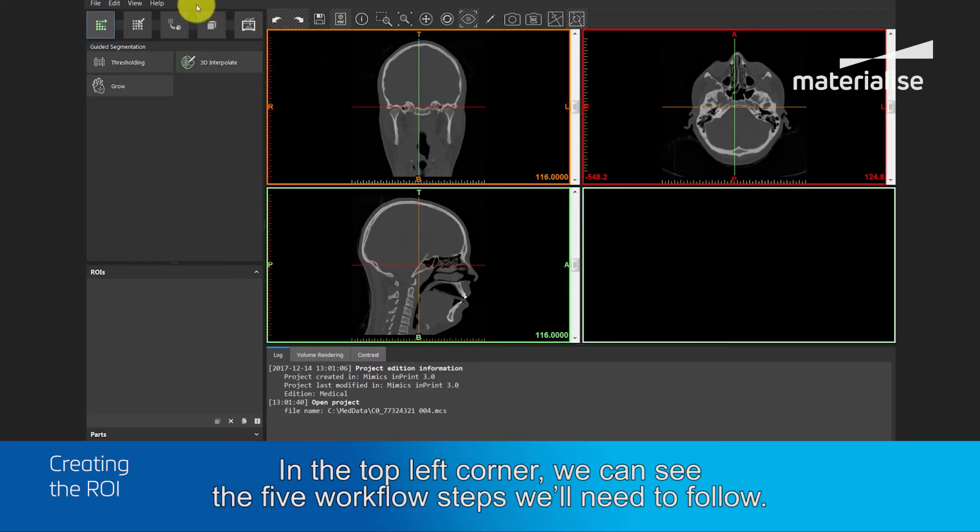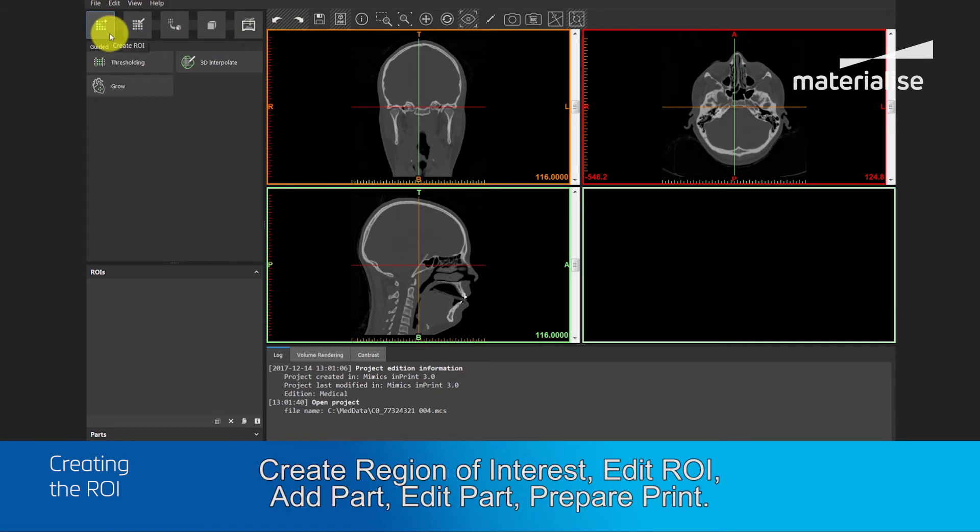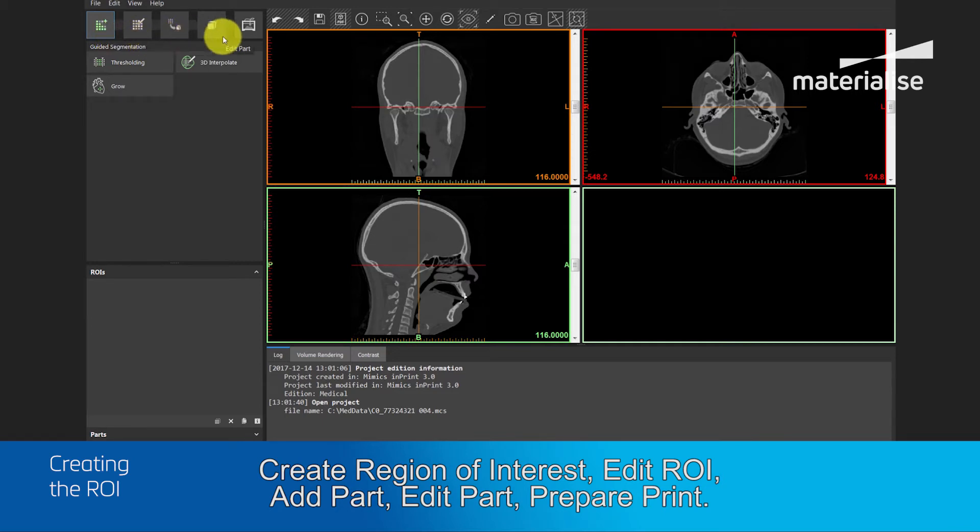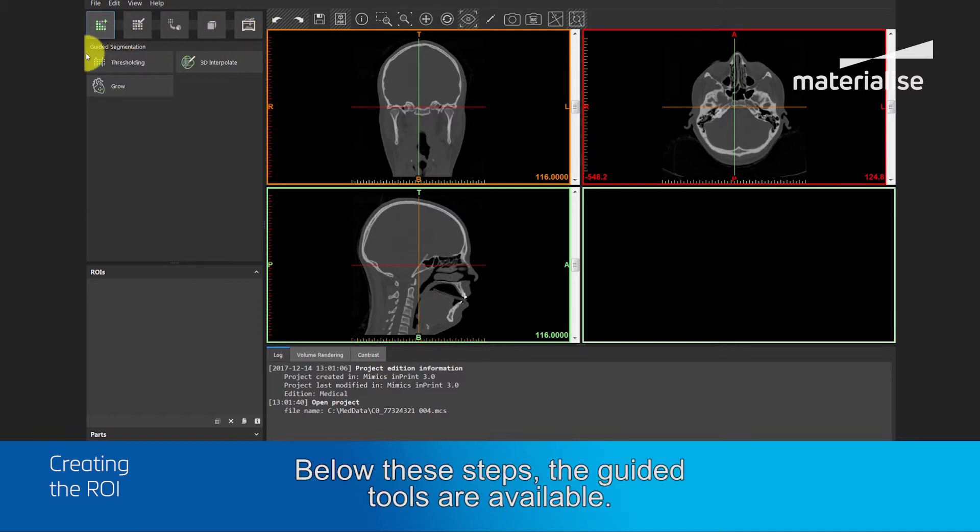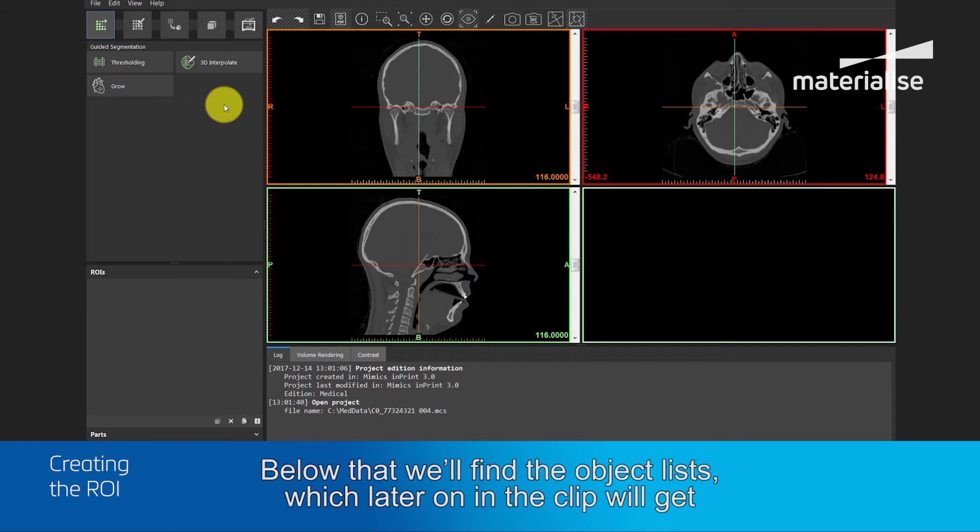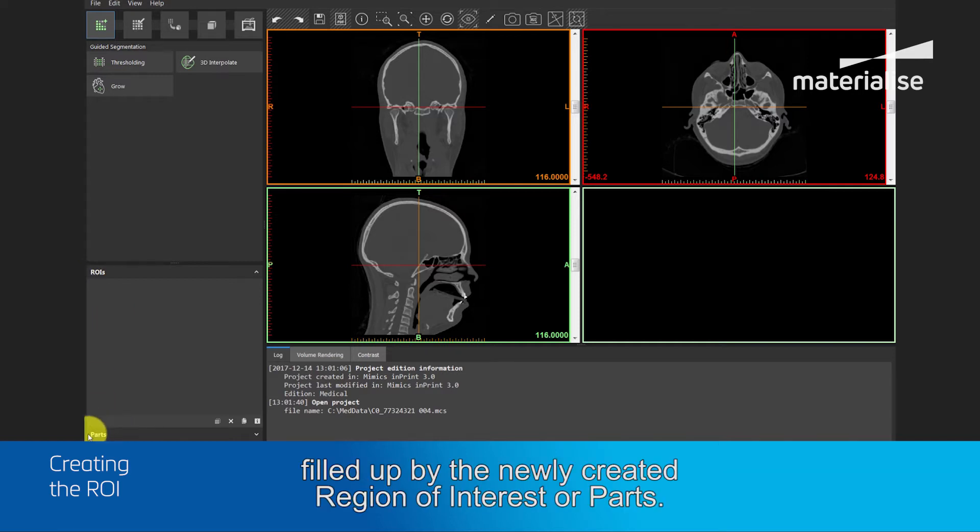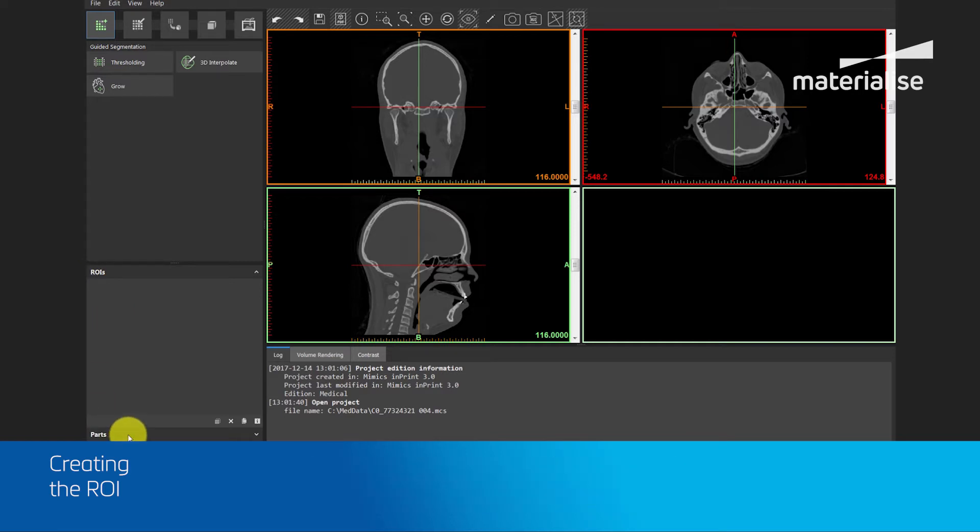In the top left corner, we can see the five workflow steps we will need to follow: Create Region of Interest, Edit Region of Interest, Add Part, Edit Part, Prepare Print. Below these steps, the guided tools are available. Below that, we will find the object list, which later on in the clip will get filled up by newly created Region of Interests or Parts.